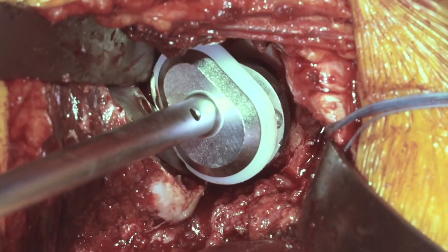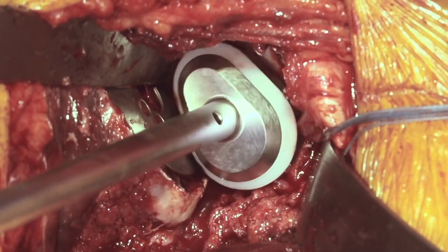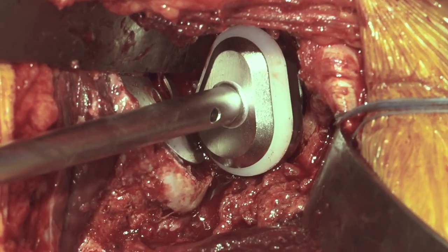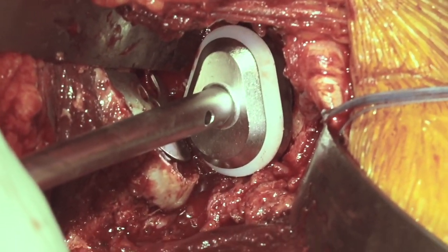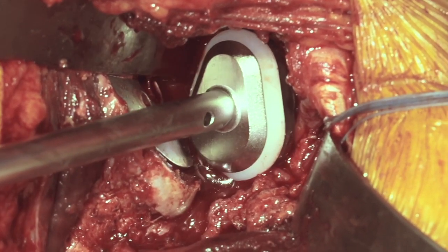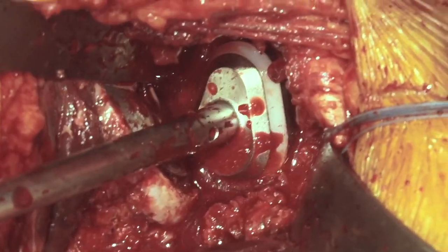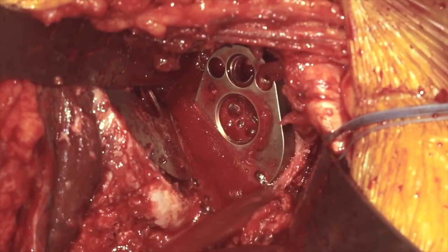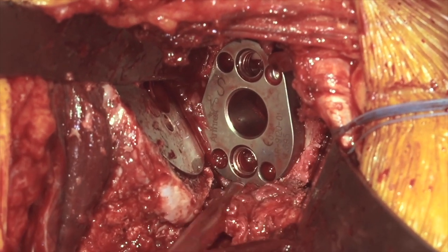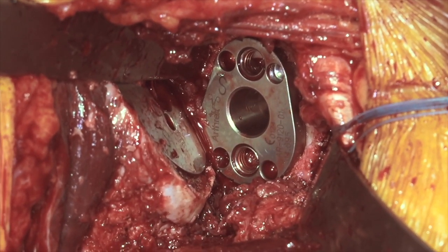We'll seat this down into the prepared position, dial it into our anatomic position lining it up from top to bottom, and then impact it into place. We can see our glenoid component is nicely seated. There is even a little ridge of bone inferiorly, which is ideal. All the way around we have a nice seating of the glenoid component.